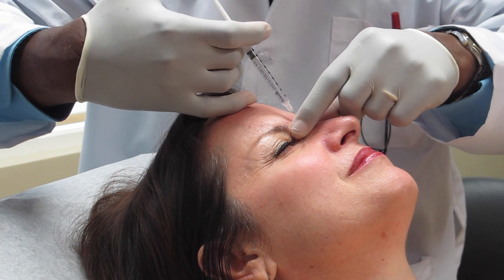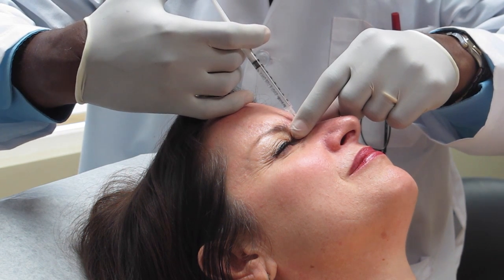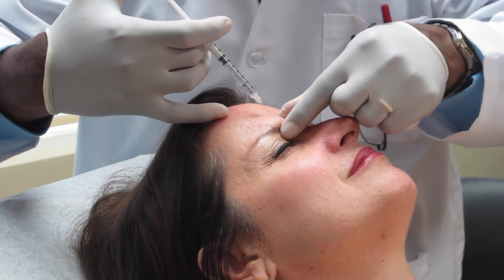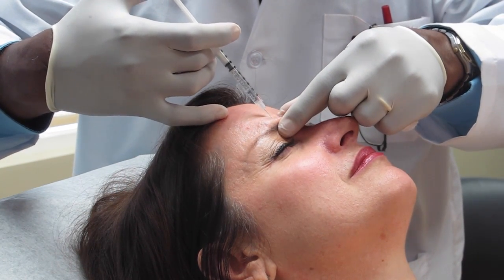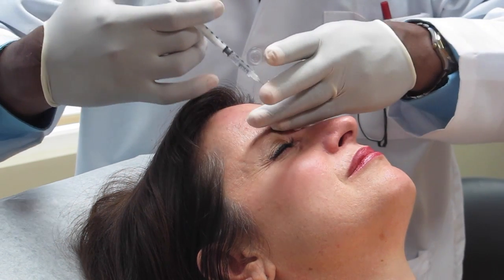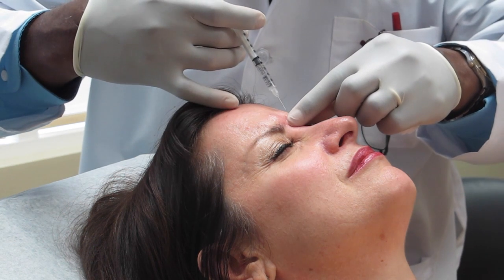Here's the first injection. And then a little in the middle here. And then the last little bit we put on the left side.